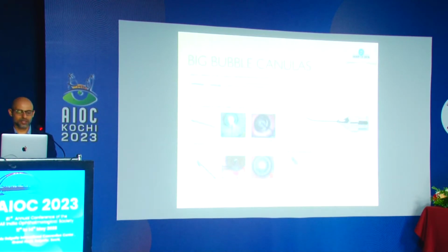Cannulas are very useful. These are big bubble cannulas. Many surgeons have designed some. Dr. Fogla has one, Dr. Sarnicola, Tan, and many others have designed them. The basic principle is that it's a cannula with a port at the bottom. So you're basically putting your cannula into the deep stroma paracentrally, and then you're injecting a small jet of air. The air finds its way through the deep stroma and detaches the predescemetic layer.